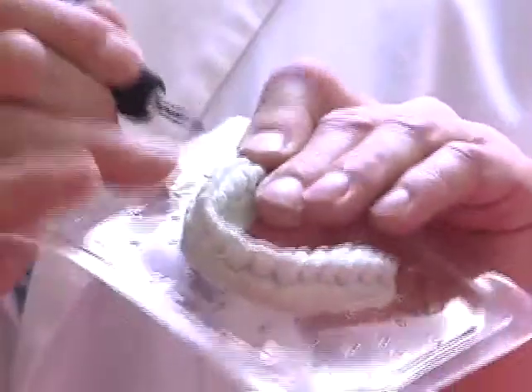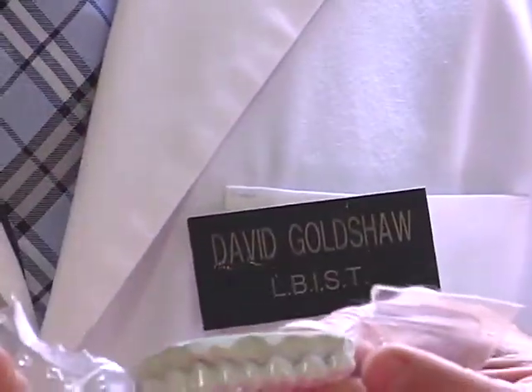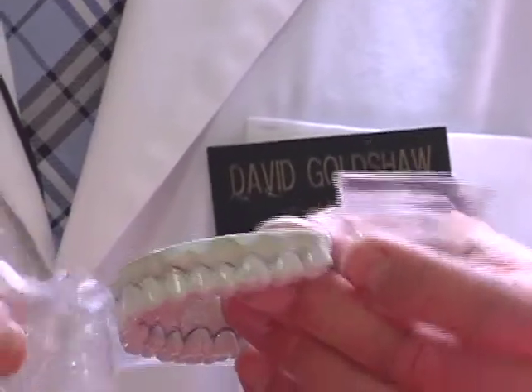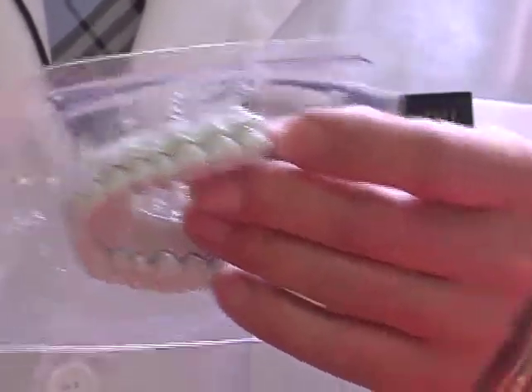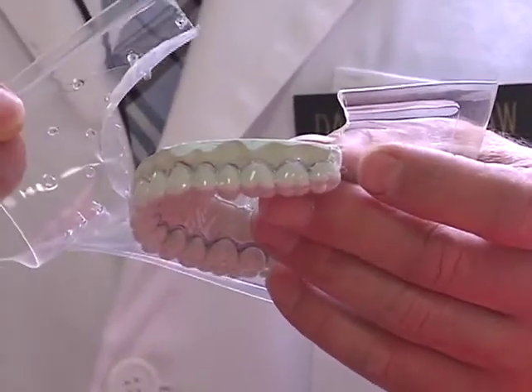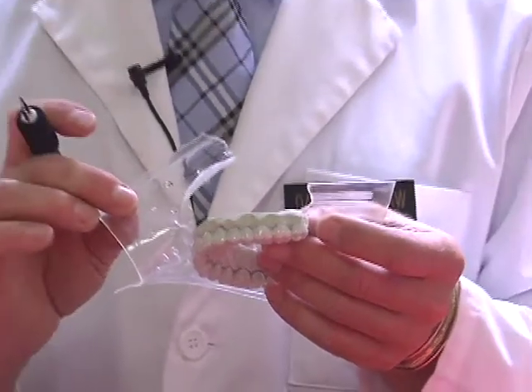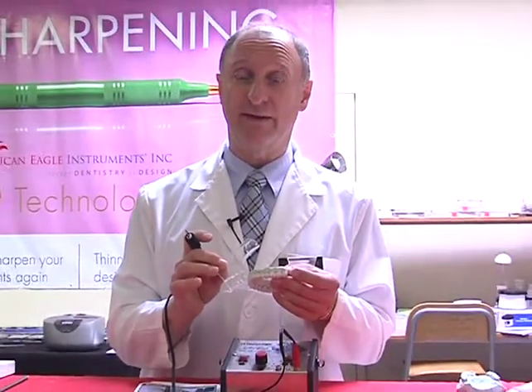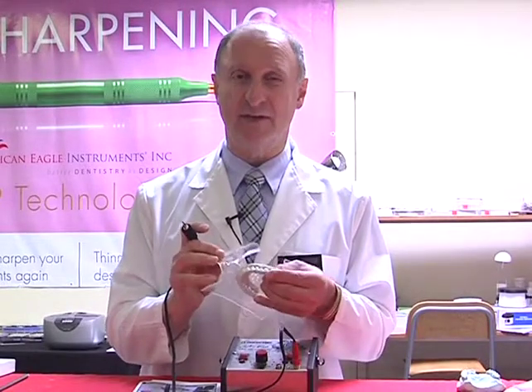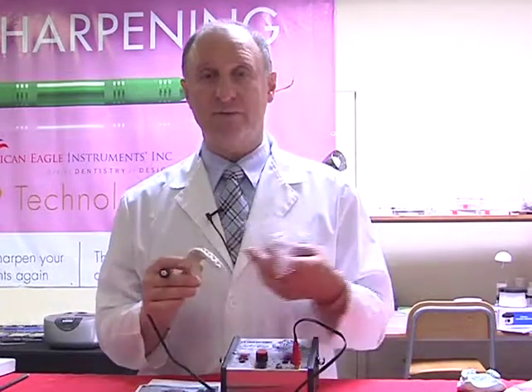So let's just see, I've gone almost halfway through, and peel off. And this is exactly what we need to look at: we've got a nice smooth edge that has rolled itself over. That edge is going to provide a nice, smooth, comfortable fit inside the mouth, but more importantly, something the patient will feel very comfortable when their tongue is over the surface. So not something that's going to interfere. I'll finish trimming this up and we'll come back in just a moment.